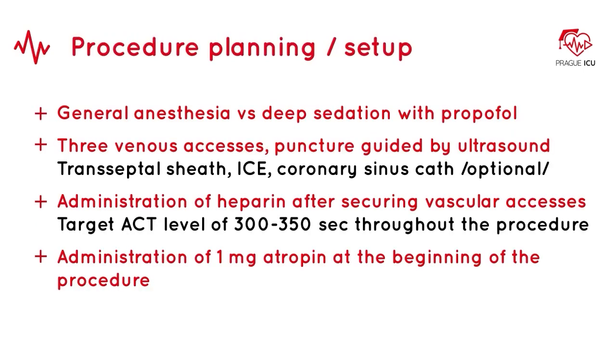The shown procedure is performed in general anesthesia, but alternatively, deep sedation using propofol can also be effectively used. We currently perform about half of our cases using deep sedation and propofol.